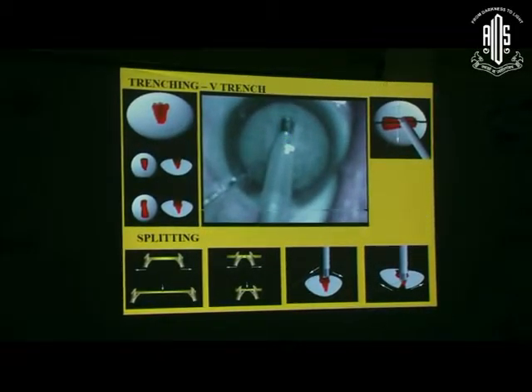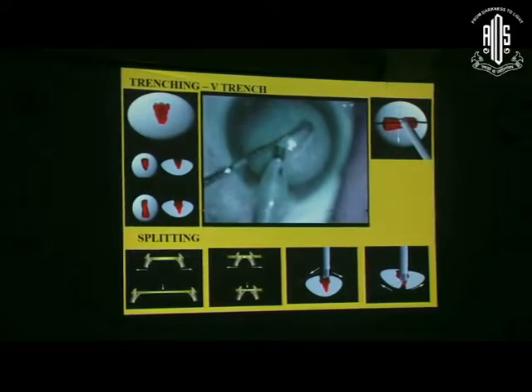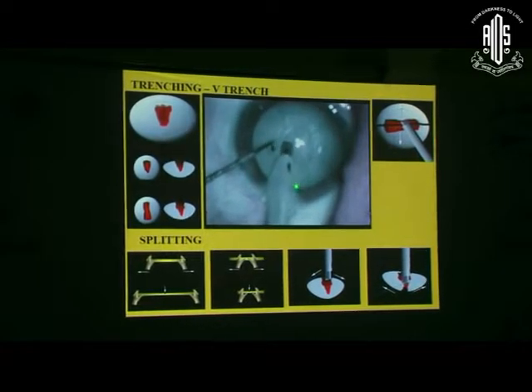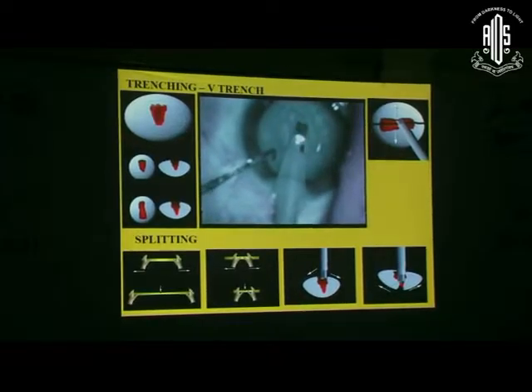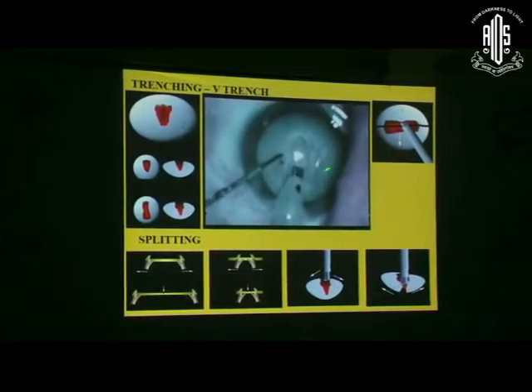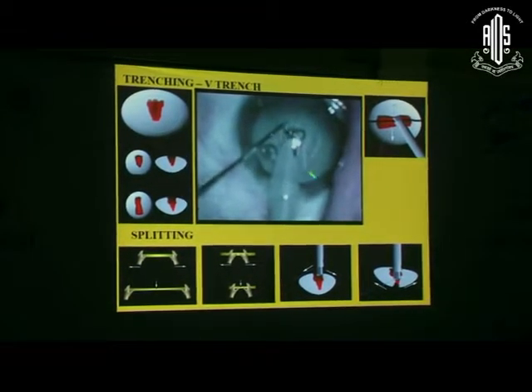There should be no pushing of the nucleus - deliver the energy adequate for cutting the nucleus, neither too much nor too little. In a harder cataract, it should not occlude more than one-fourth of the tip of the phaco probe. Now because of this V shape, the phaco tip is like a V because of the sleeve. If you make a straight simple trench in the center, the sleeve does not get accommodated into the trench, so when you are trying to trench, the sleeve will keep on offsetting and will not allow you to go into the depth. But once you have made a V-shaped trench, the sleeve can get accommodated very comfortably and you can go deeper.